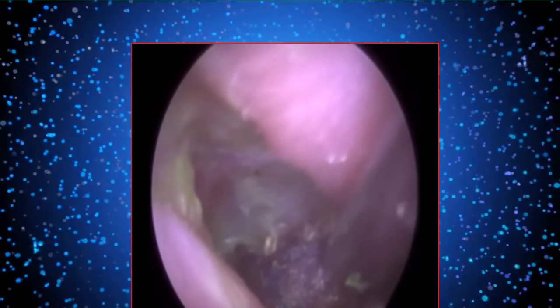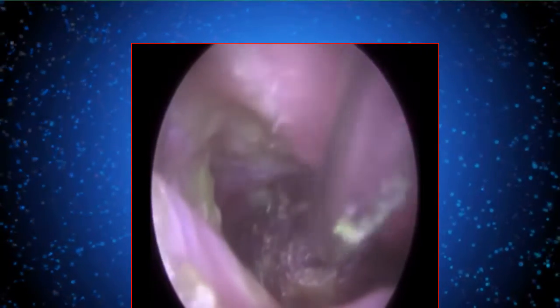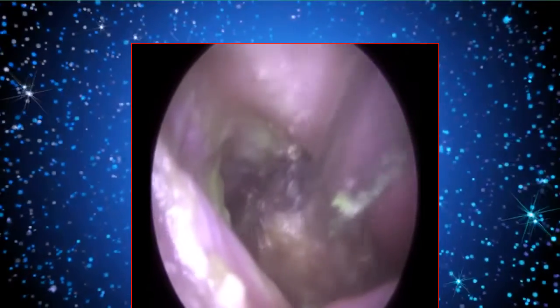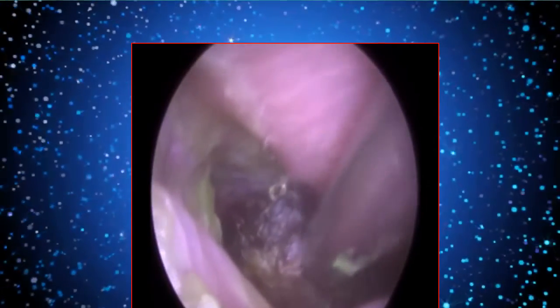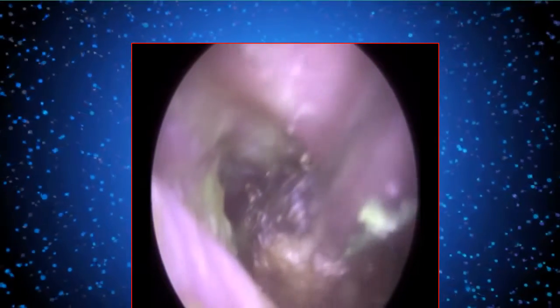And you can just see now how much swelling there is. You can see the ear canals are really enclosed, the wax, this debris is engulfed within the swelling. I'm just trying to wriggle it out. It's just getting trapped at that point.